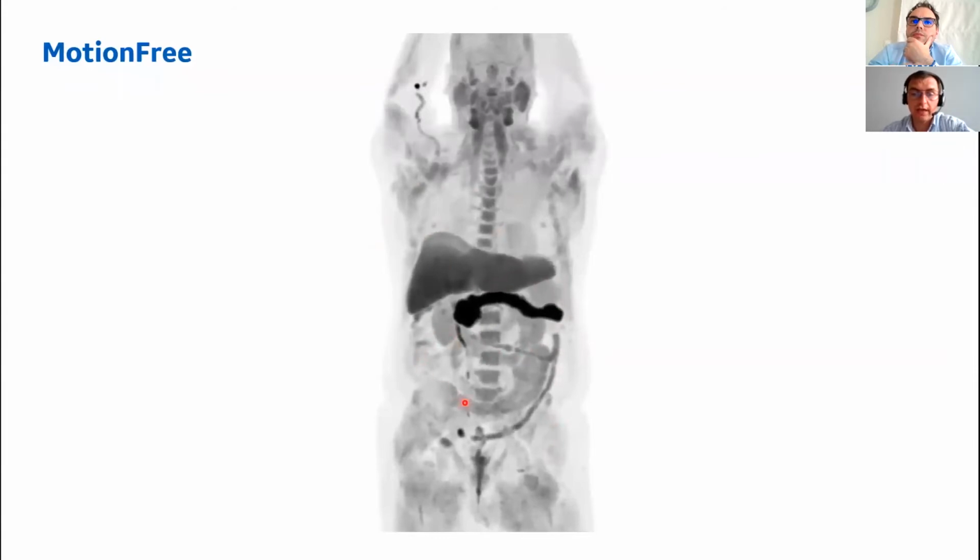Please have a look at the abdomen area, how all the intestines and lower abdomen areas are moving as well. So here we could confirm that respiratory motion is affecting the entire abdominal and chest area and not only the middle part.